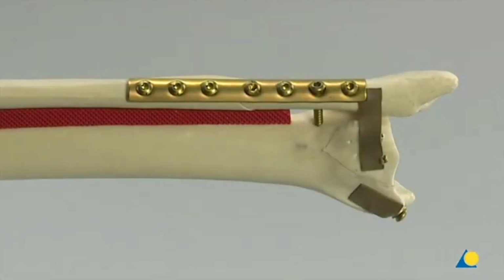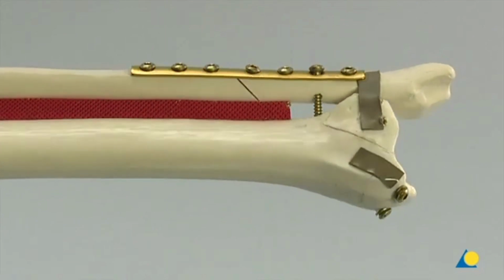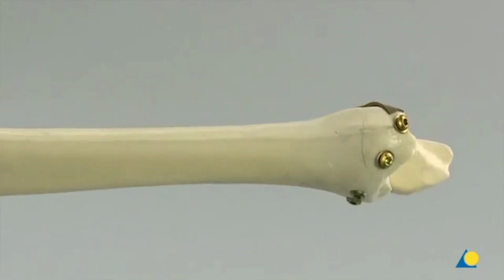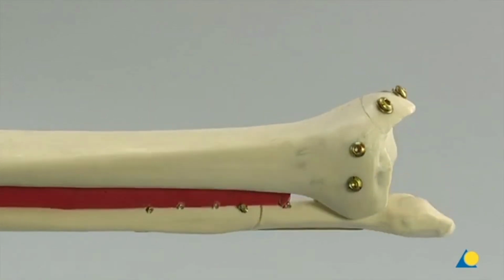The internal fixation is performed with a 7-hole LCP 1/3 tubular plate using a lag screw through the plate. A position screw is used to secure the syndesmotic ligaments. In addition, a lag screw is used to fix the medial malleolus, and a screw fixation of the posterior malleolar fragment from anterior is performed.